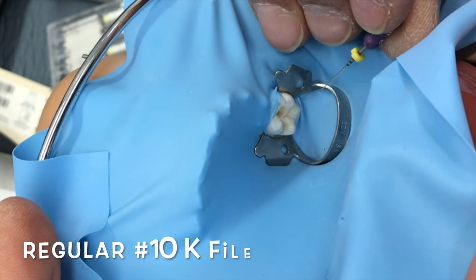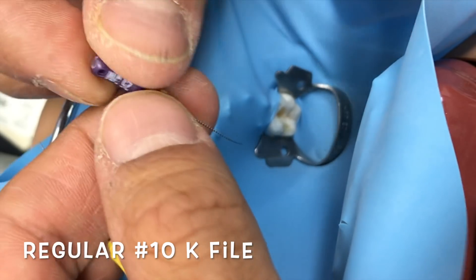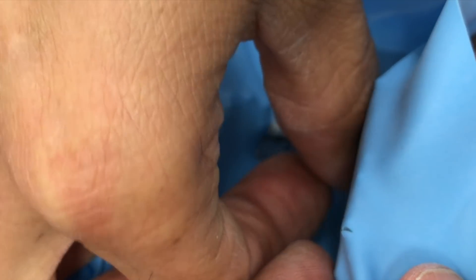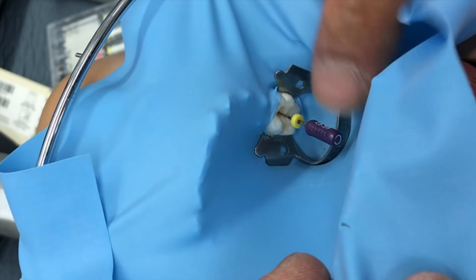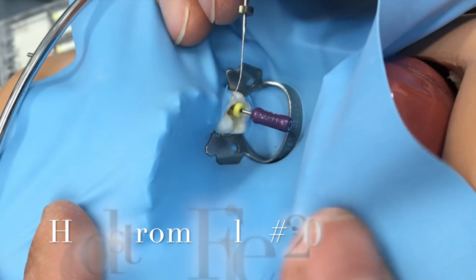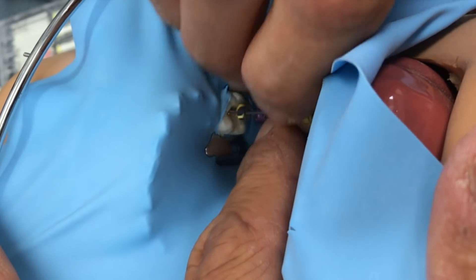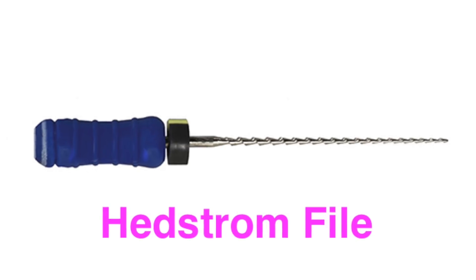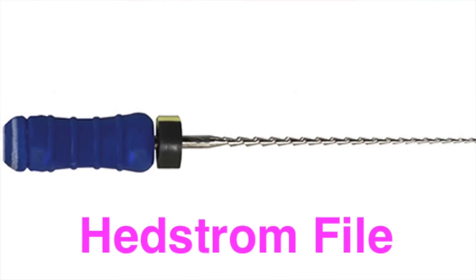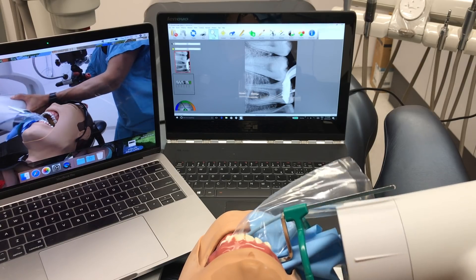I'm going to place this file at 20mm into our mesial buccal canal — right there — and push that down to length. This gives us a different shape; you can kind of see the shape difference. I'm going to place that in the mesial lingual and spin that down; it may not go to working length, and actually I don't want it to. Let's try the distal shift to start.